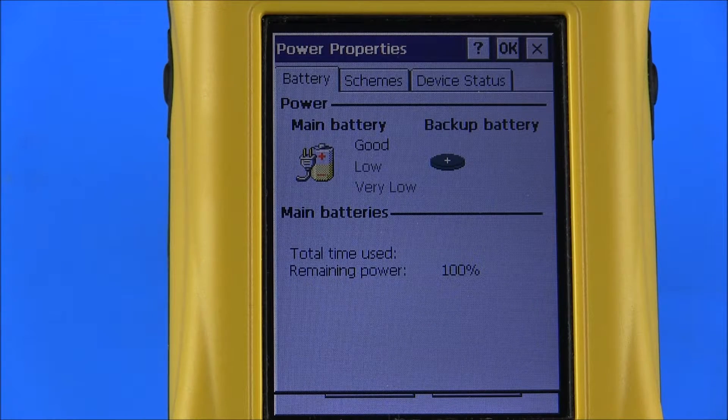Selecting the Power Properties icon will bring up the Power Properties menu. Selecting the Battery icon will display the status of the main battery, which powers the reader, and the percentage of remaining power. The backup battery functions to maintain the time and date for an additional period after the main battery is completely discharged. If the reader is without power for an extended period, the time and date will need to be re-entered, but all data and user settings will be maintained even after all battery power is lost.